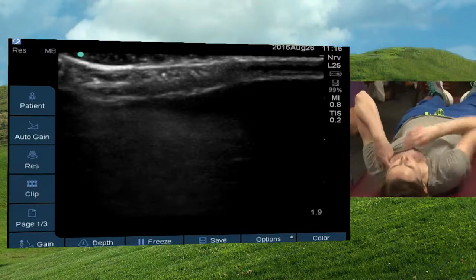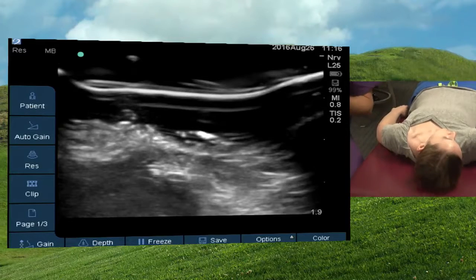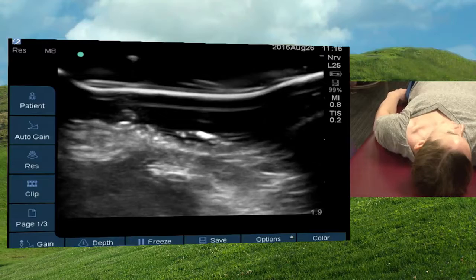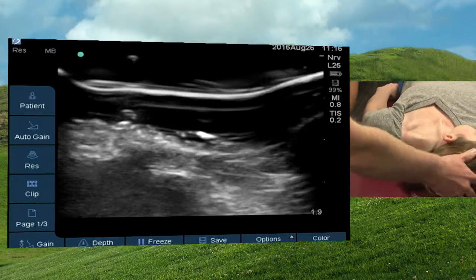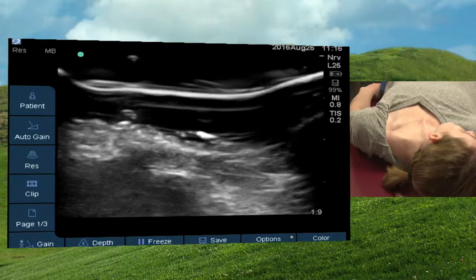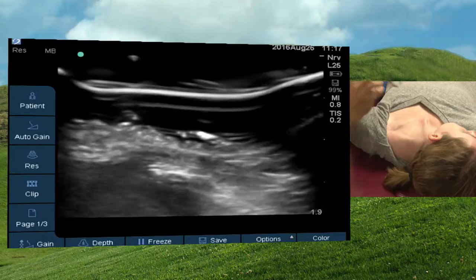So the next thing I'm going to examine is Dr. Roberts' veins in her neck. And just because you're a third or fourth year student, that doesn't mean that the neck is necessarily off limits to you. I wouldn't go complacently putting in internal jugular catheters as a third and fourth year student, but almost everybody, and Beth is a great example, has external jugular veins here, and all ultrasounded. It's a peripheral vein just like anything else, okay?